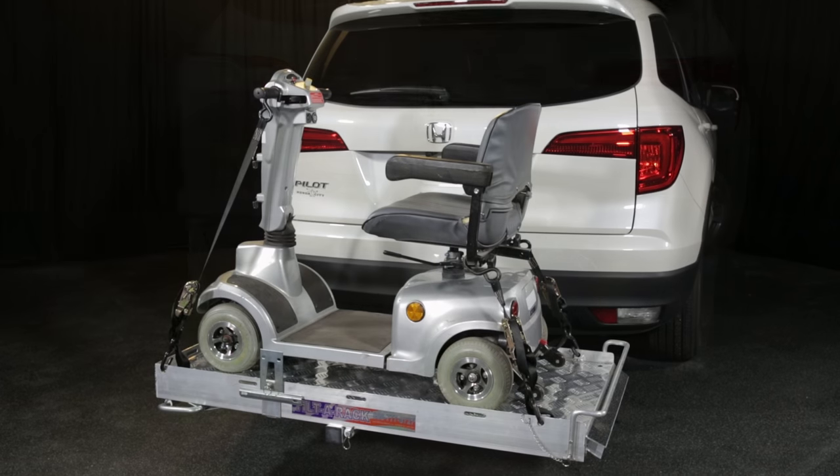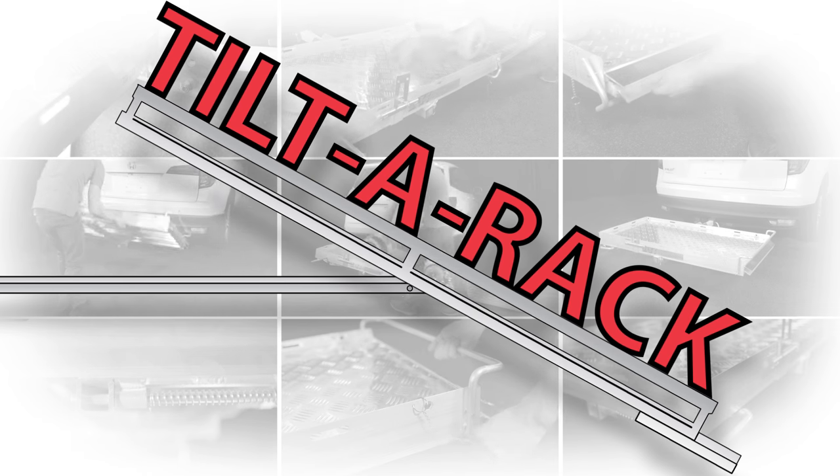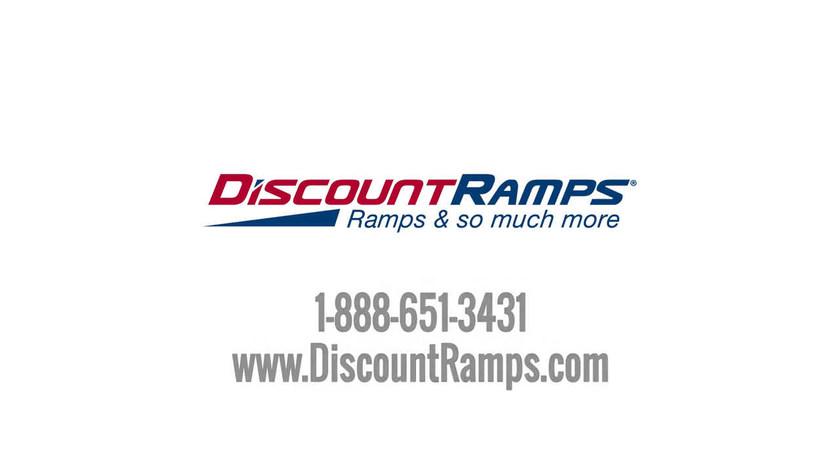Convenient and affordable, order the exclusive Tilt-A-Rack Mobility Carrier online from DiscountRamps.com today.